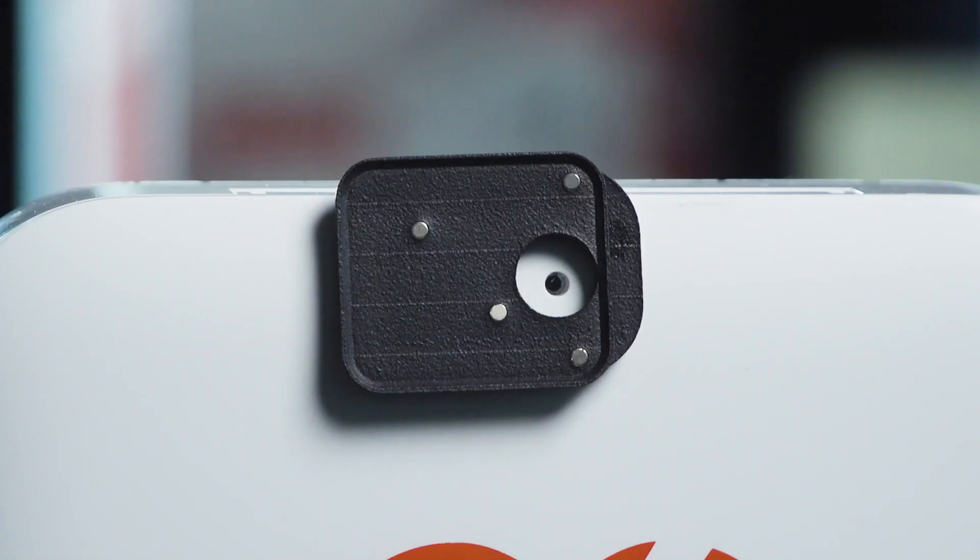Note that every AED model requires a unique base for the sensor, as shown here.